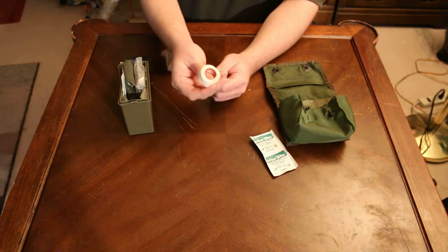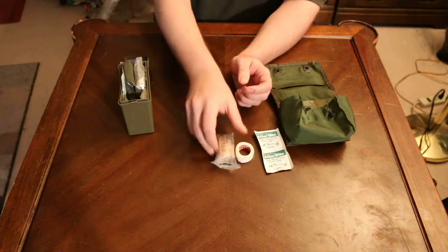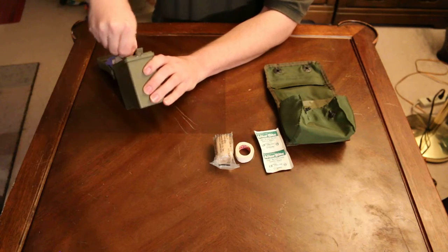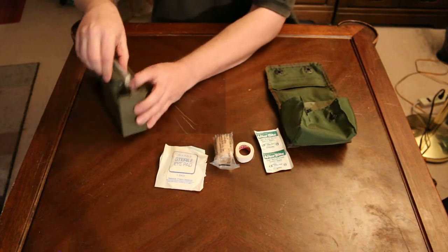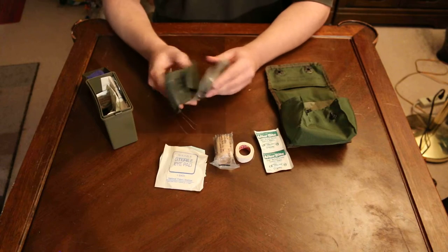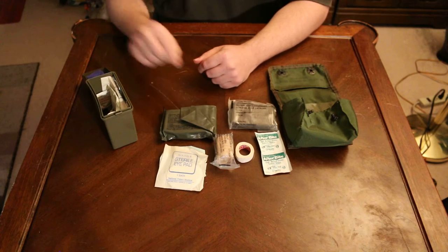I have here a small roll of tape, one roller gauze. This one is very tightly packed. Two sterile eye pads, one field dressing and one muslin triangular bandage.